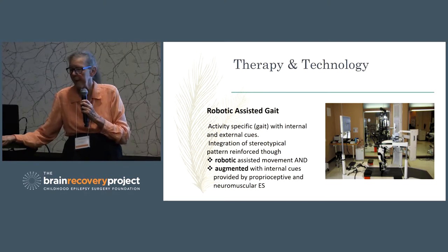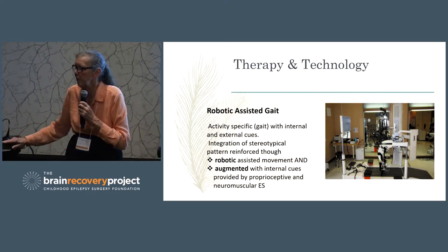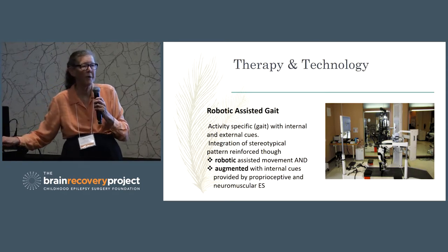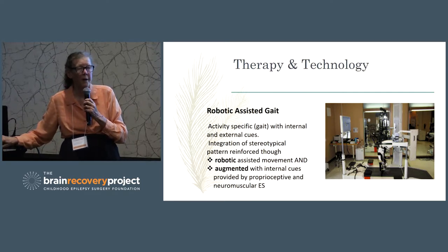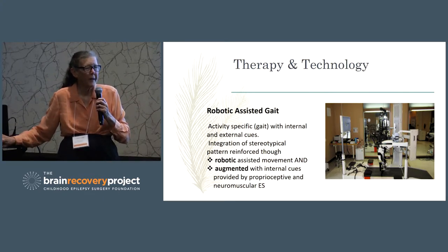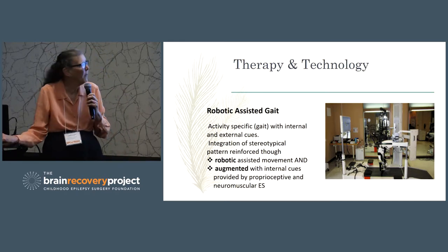At the end of this talk, I'm going to talk to you about how you, as patients and therapists, are responsible for making sure that all this technology is used correctly, because the technology itself is not going to create the motor learning and motor control that you want your children to have. It's the combination of the technology with the therapeutic background and the functional activity that's going to make a difference in how you teach your child's brain to move their extremities.